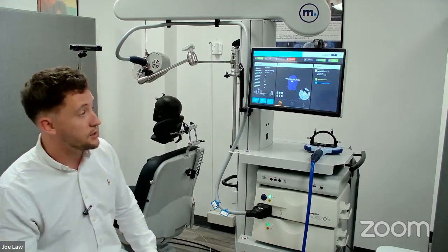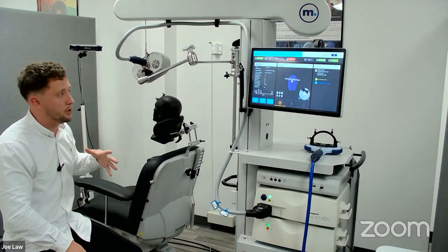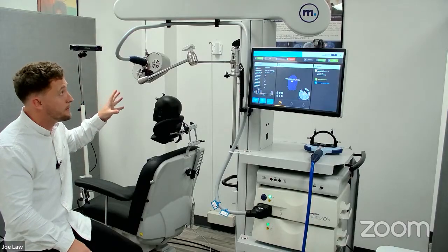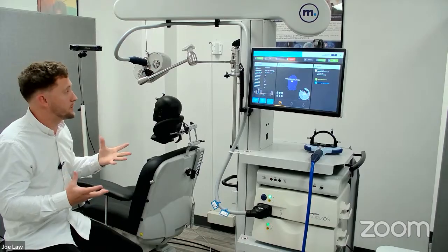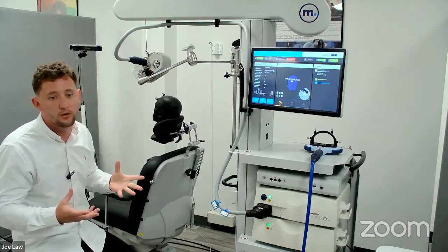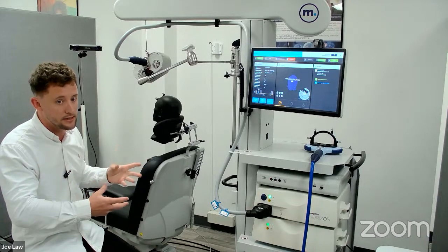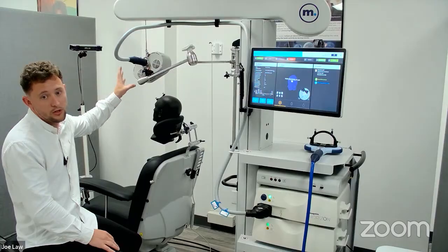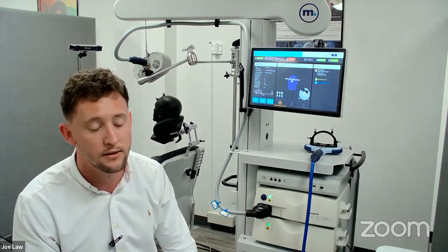The beauty of that as well is it's very serviceable. Say, for example, you want to purchase a new coil or you want servicing on a coil, the user can actually swap this out themselves. Obviously with, say, a liquid cooled coil, it becomes very difficult to service. There's liquid in the coil, there's kind of toxic liquids, etc. And with this system, you can swap this coil out within a matter of a minute. So very serviceable as well.